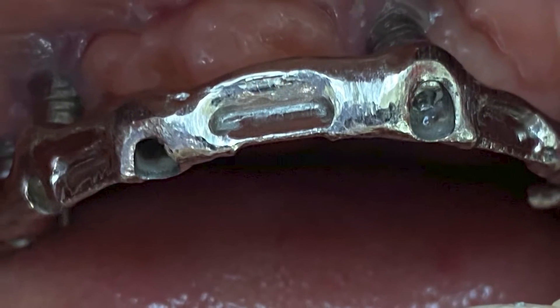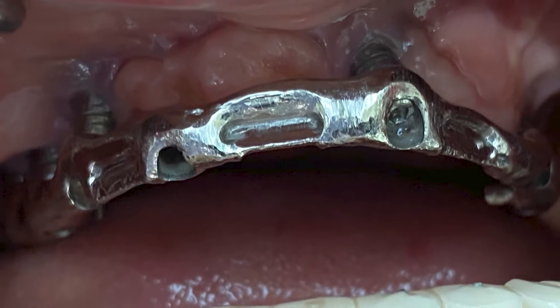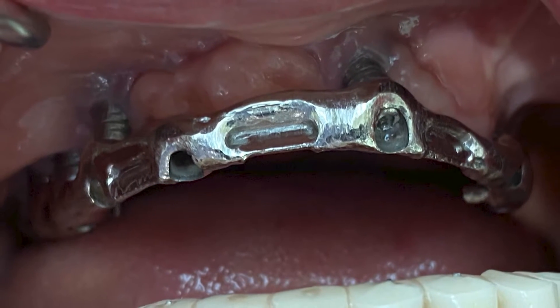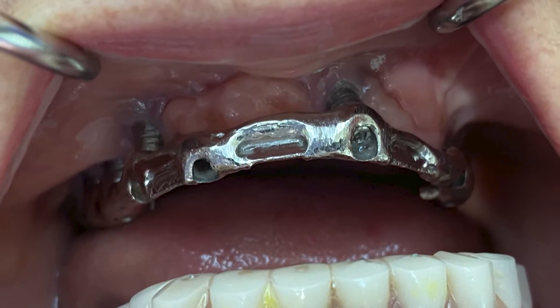Now, why is that important to block out? Because one of the worst phone calls we get is when the prosthesis gets locked in — meaning something that was removable is now fixed. And what do you do? You have to grind it out and destroy that beautiful denture that your laboratory has fabricated.